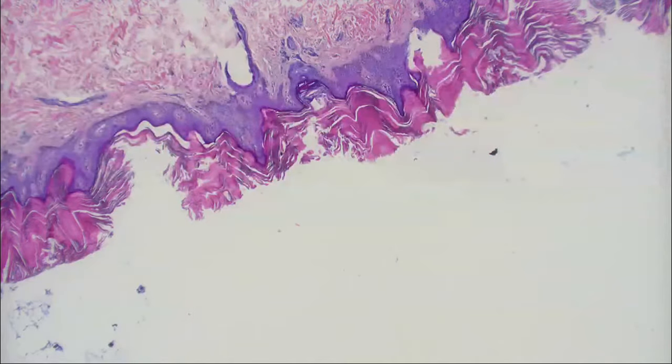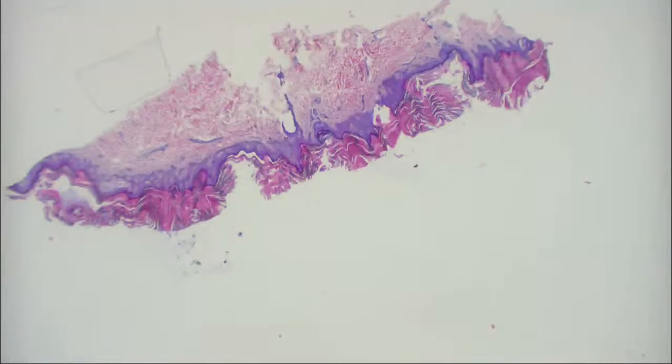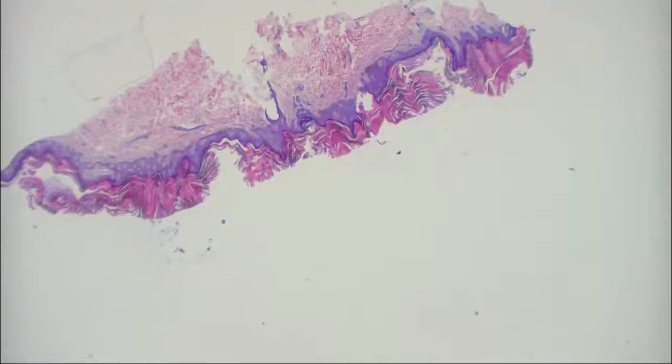pityrosporum. Go to the next slide. So these are some of the items of the difference. This was basically CARP. Just notice the morphology. It kind of looks like a seb, but it's widespread, and it's not a seborrheic keratosis clinically. So that was CARP.